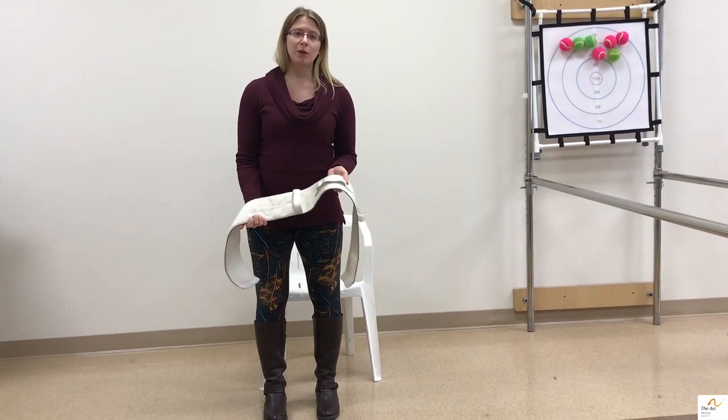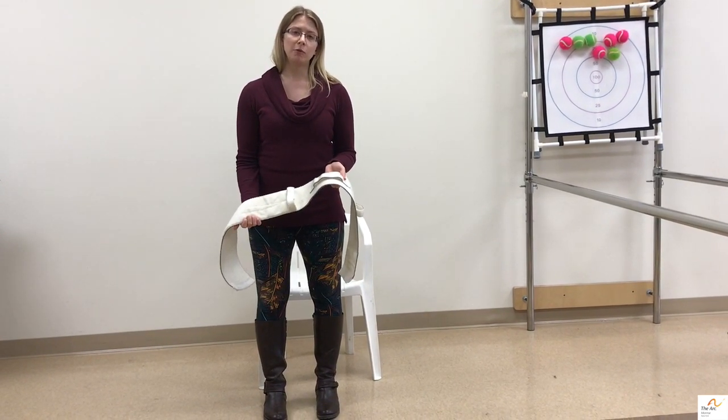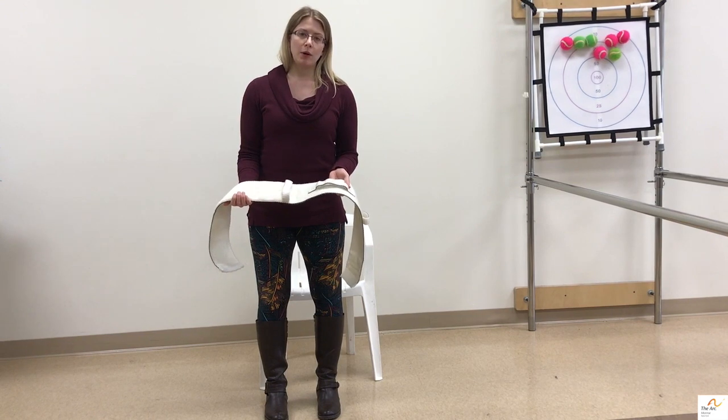Hi, my name is Randi Swift. I'm an occupational therapist here at the Arc of Monroe and I'm going to talk with you about gait belts.